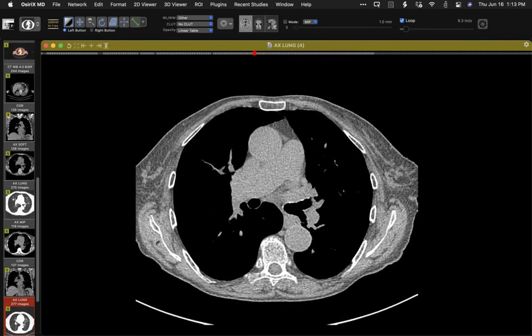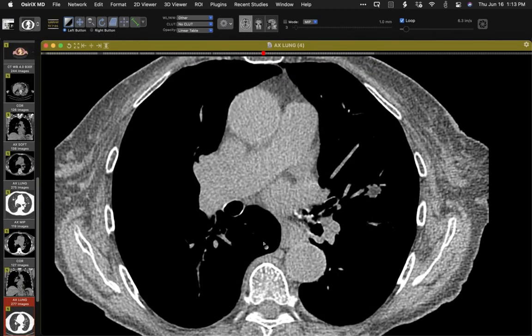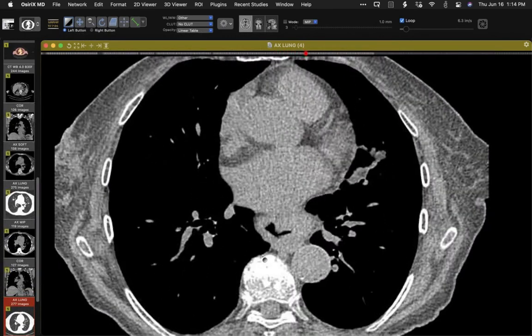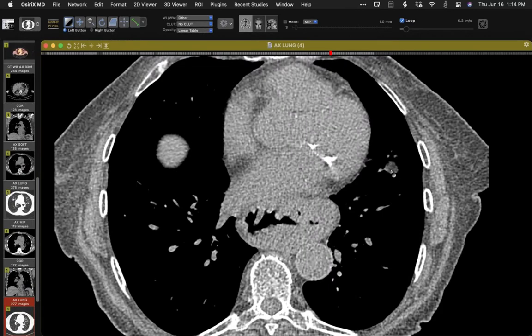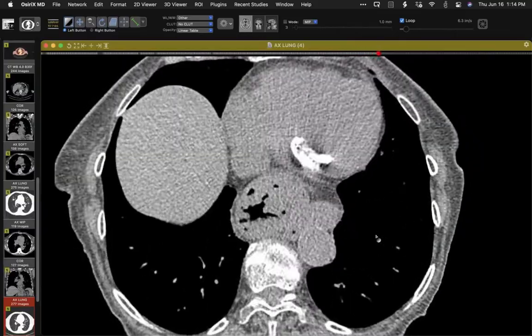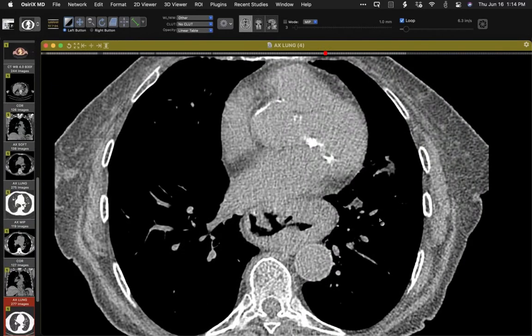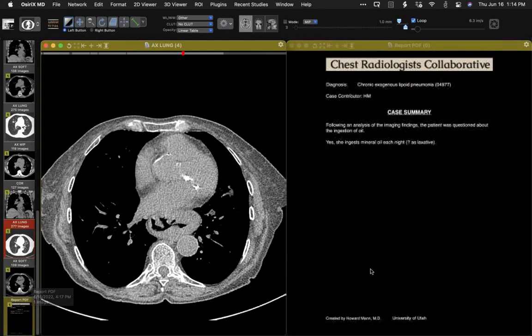Let's scroll through in a mediastinal window and look at the attenuation of the bigger ones. That's fat — about minus 140 to minus 141 Hounsfield units. I showed an exogenous lipoid pneumonia a couple of weeks ago. We don't know for certain, but presumably she sleeps prone, which is why she's aspirating anteriorly. After making that diagnosis, we asked the physician to re-question the patient — and she ingests mineral oil each night, probably as a laxative.